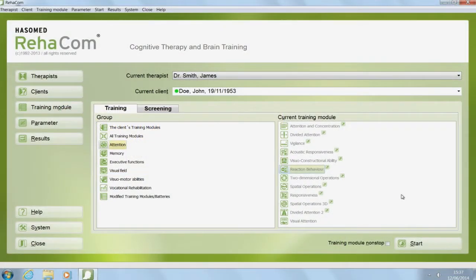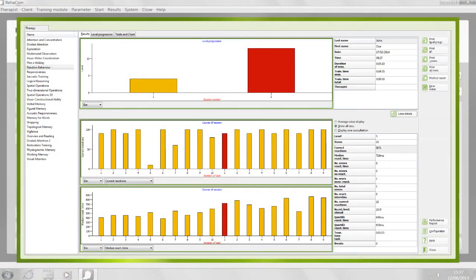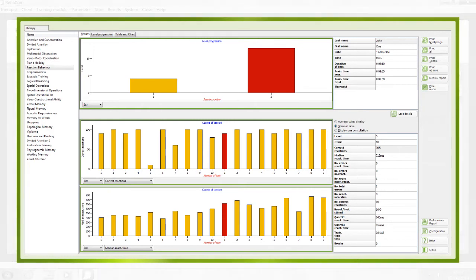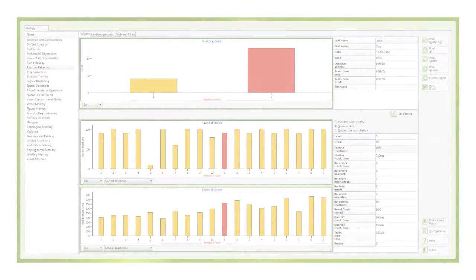At the end of a training session, RehaCom will create an evaluation graph. Training results will always be saved automatically, and the patient will continue from this stage when starting the next training session.